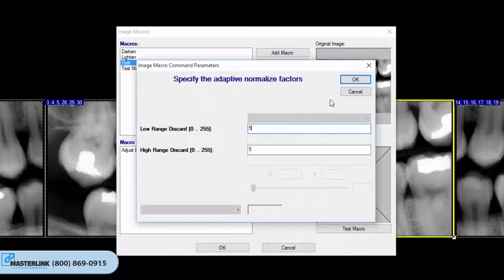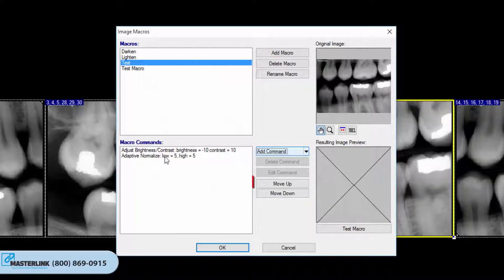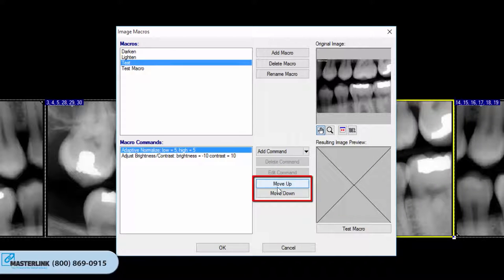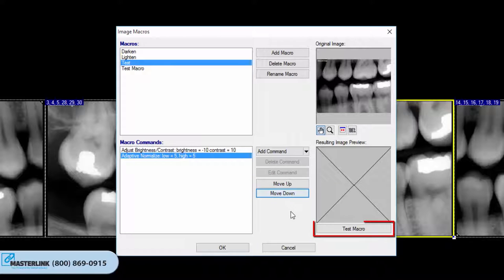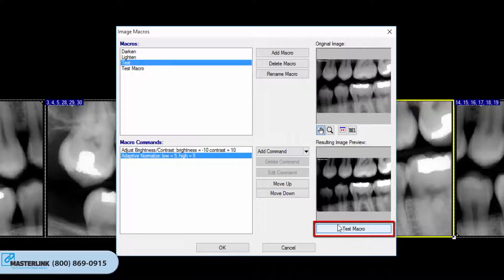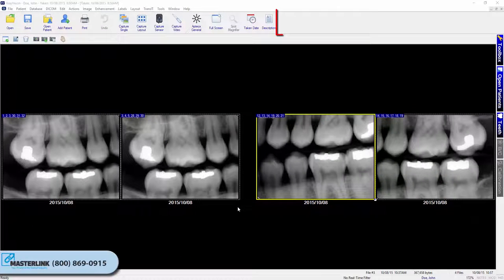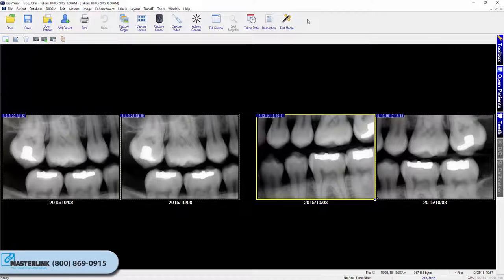To change the order, select the desired command and use the Move Up or Move Down button to place it in the desired position. Click Test Macro to preview the resulting image. If satisfied, click OK to exit. Once the macro is created, a user can customize their toolbar to include a button for the new image macro. Refer to the Customizing the Toolbar and Toolbox video tutorial for more information on creating a custom macro button.